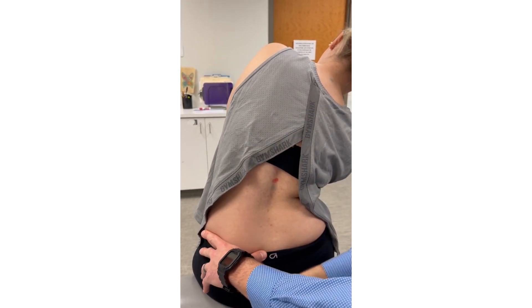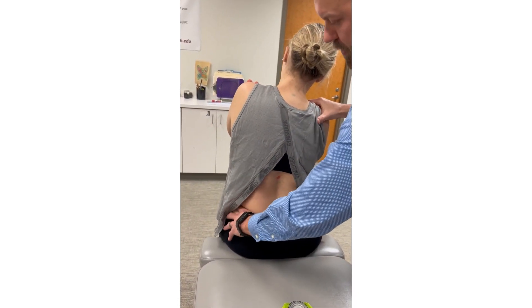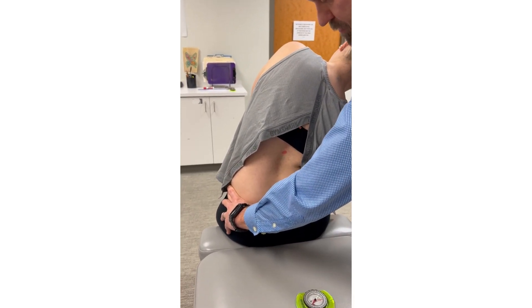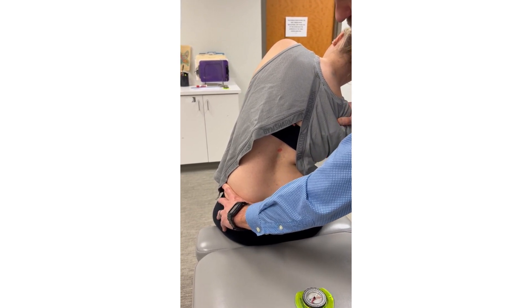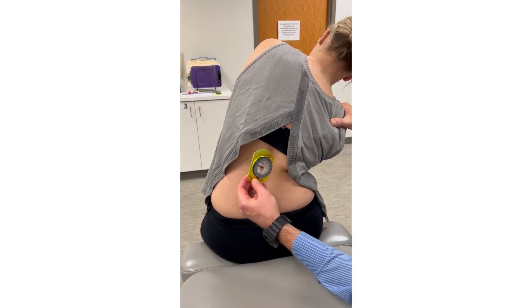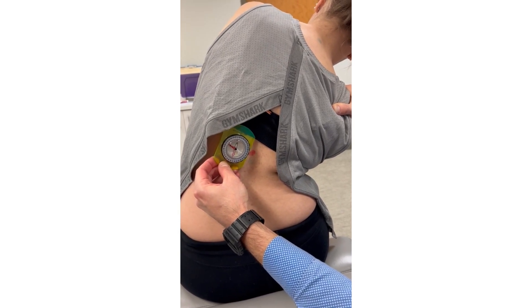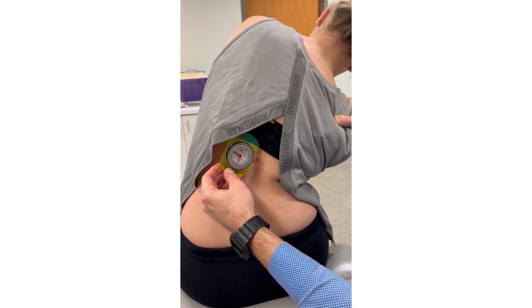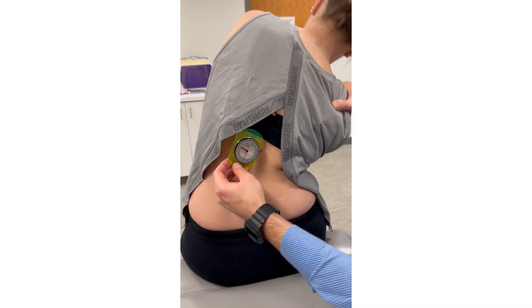We can also measure that passively. Again, I'm going to stabilize the contralateral side of the pelvis with my left hand, passively move into right side bending, apply overpressure, and spring against the barrier. Once I've established that physiological barrier, as long as she maintains this position, I no longer have to stabilize the pelvis and can line up the edge of the inclinometer on the convex side of the curve at T12.